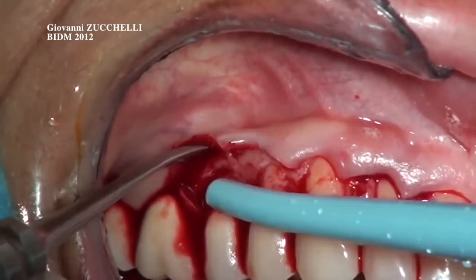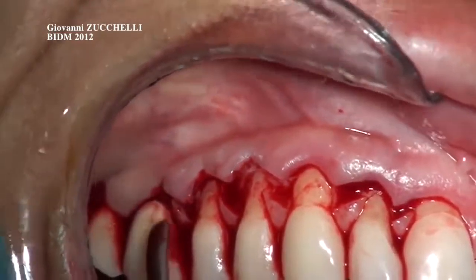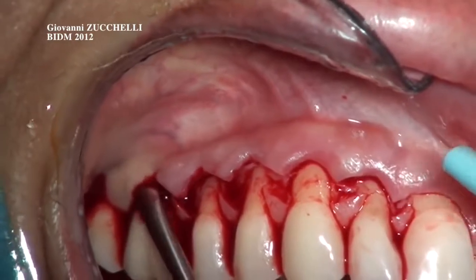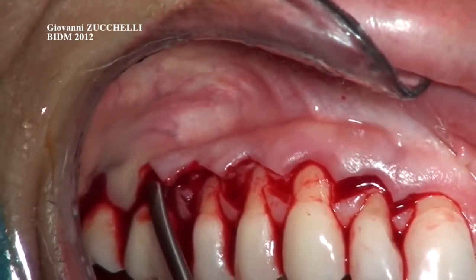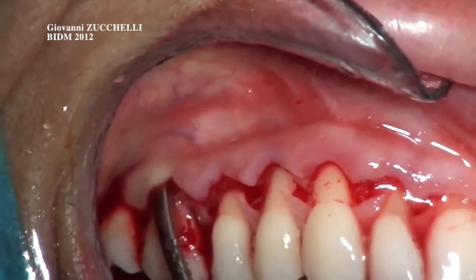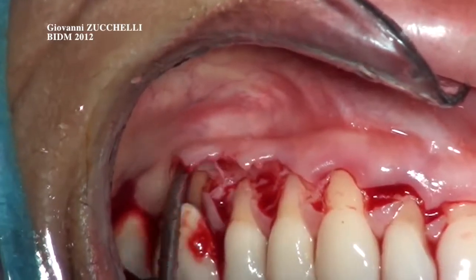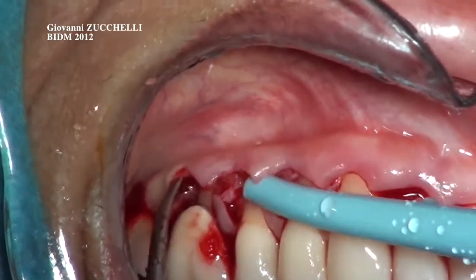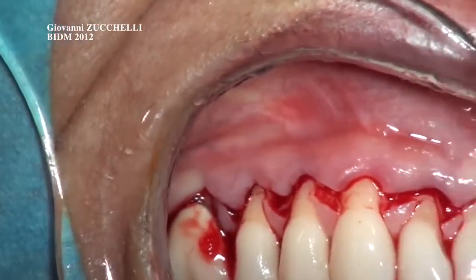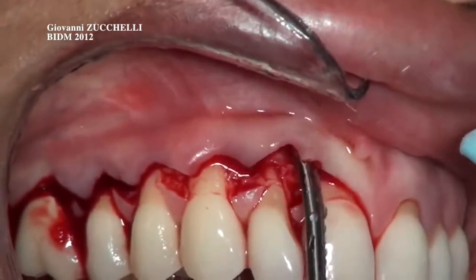Now the second premolar, 2 to 3 millimeters of bone exposure, and the same thing is done at the level of the molar until the furcation area, saline please, until the furcation area is also elevated, because we want also to cover the mesial root of the molar, and the central incisor is the last tooth with full thickness flap elevation at the level of the bone crest.